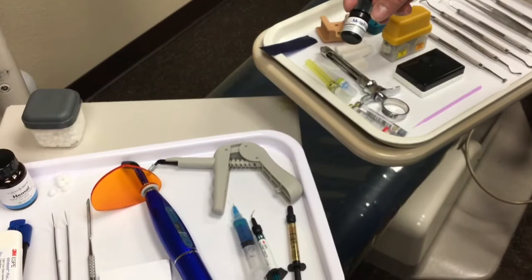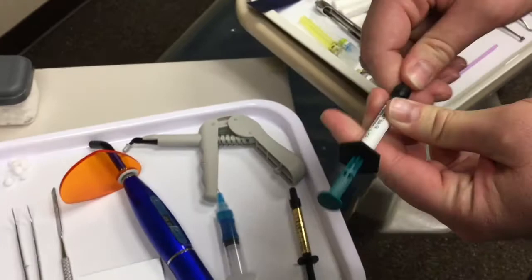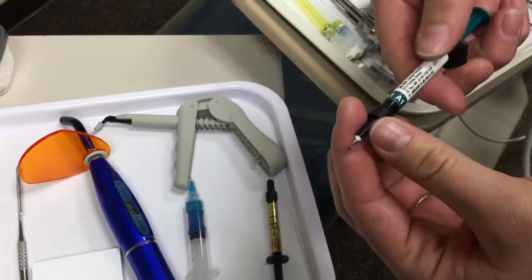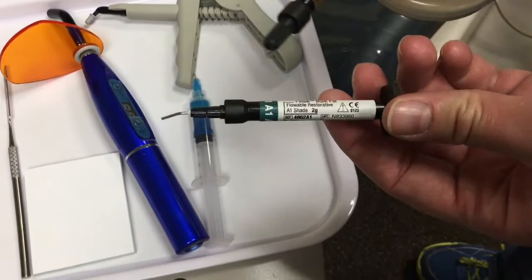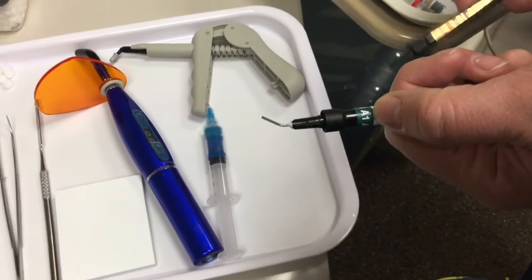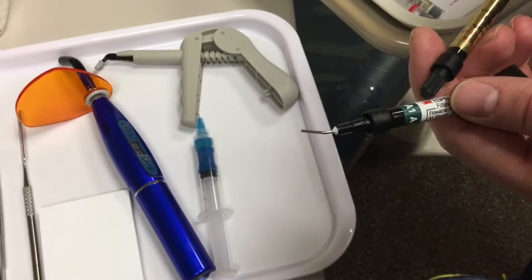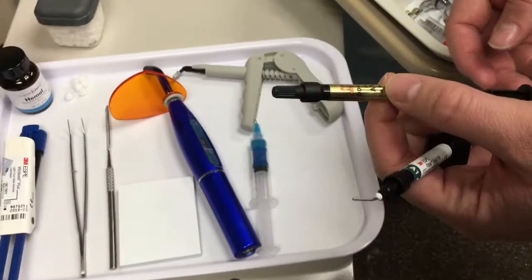After curing, the doctor will ask for the flowable composite. Again, these have one-time use tips. They come in lots of different brands and types — the one the doctors like to use here is the 3M Espe Filtek bulk fill. You always want to make sure that you're getting the right shade — particularly on front teeth, you want to match the shade of the tooth correctly, otherwise they'll be walking around with half a brown tooth and half a white tooth. This one is universal A1 and B1 — A1 and B1 are typically right about the same with no real noticeable difference.